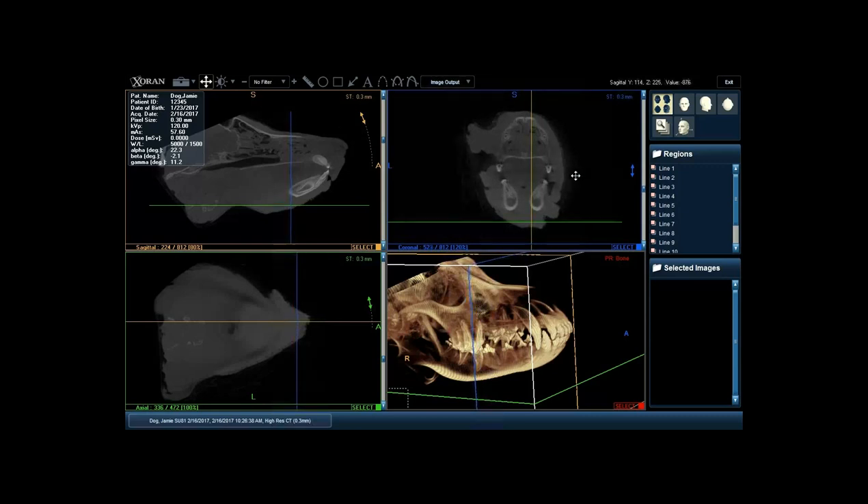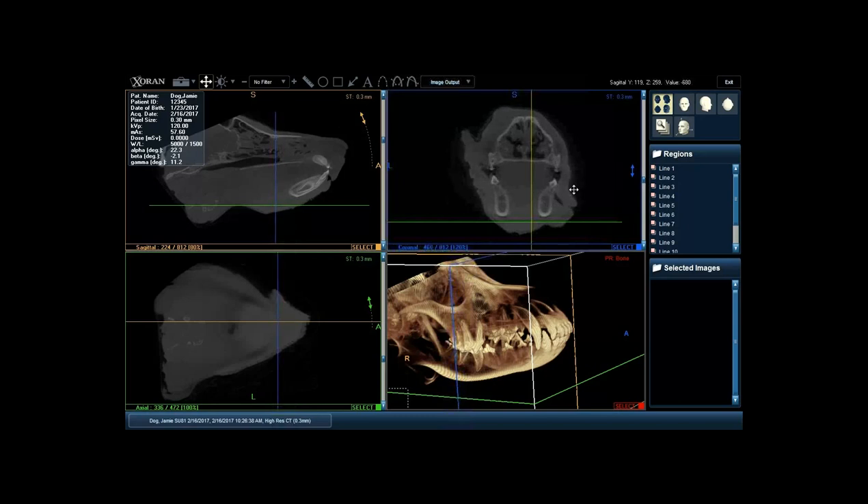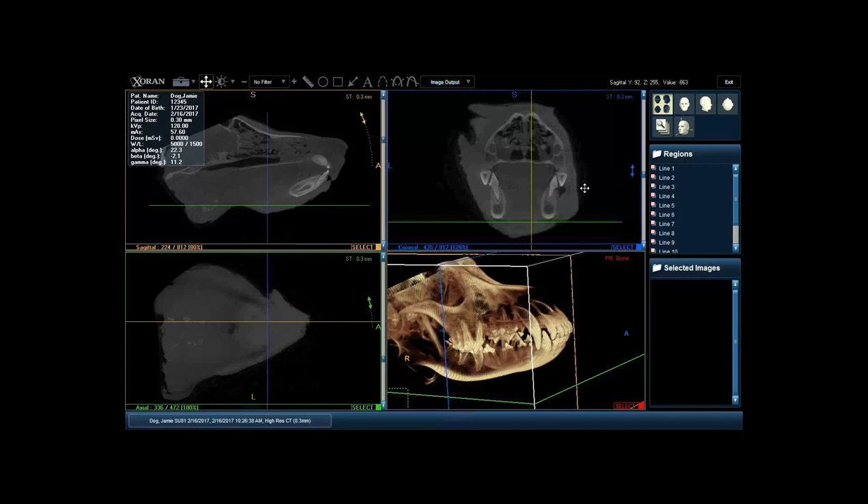We can start to see we're getting to the apex of those canine teeth on the top and on the bottom. We can see some of those roots have a bit of dilaceration to them - which can actually occur in three dimensions, as you may have noticed when extracting these teeth or doing root canals. You start to be able to identify the relationship of those two roots to the mandibular canal. Continuing back, we're getting to the level of the mandibular molar and the maxillary fourth premolar.